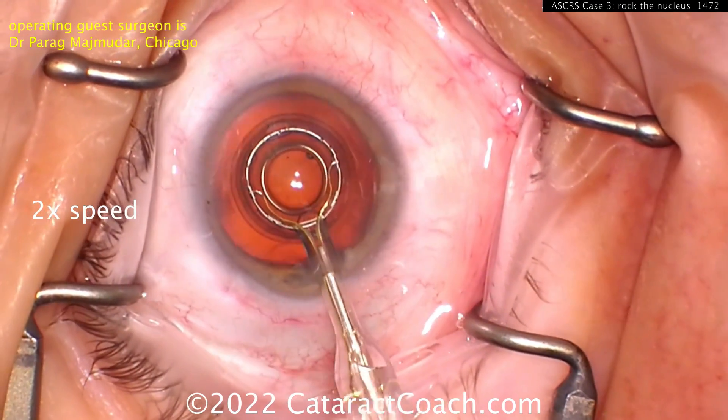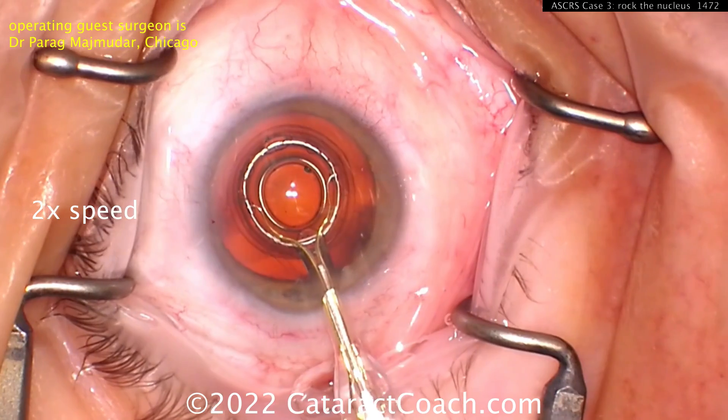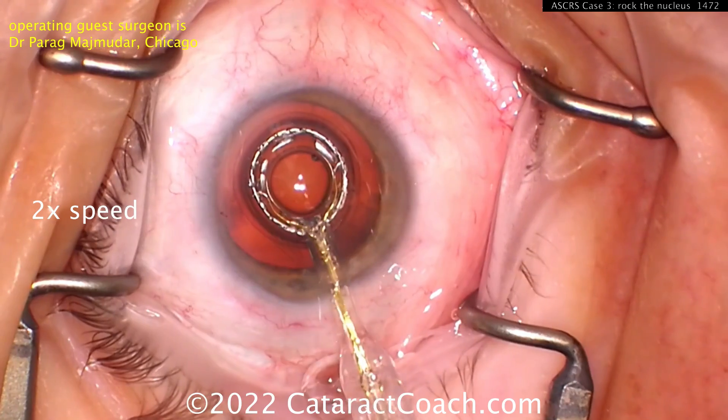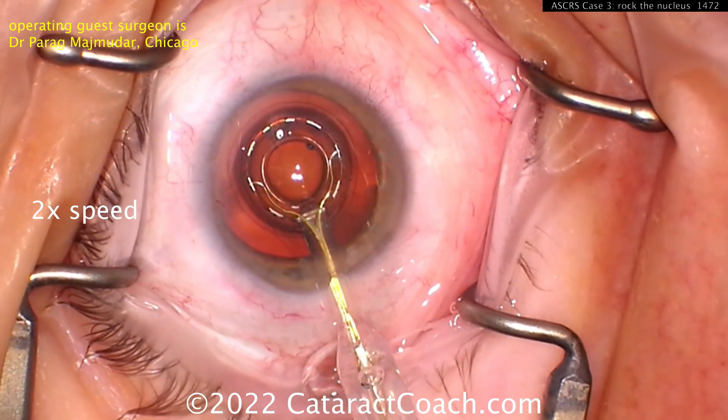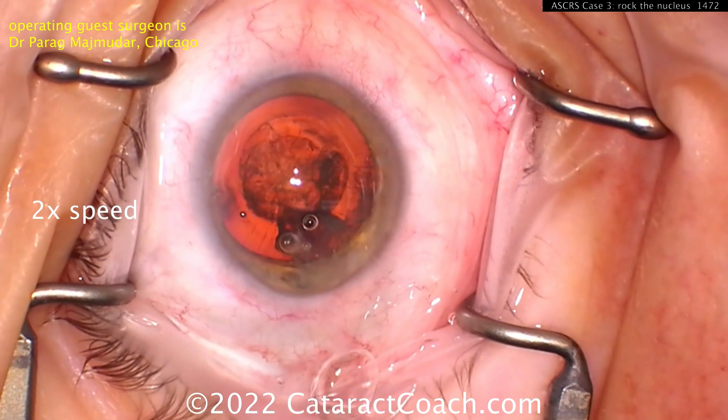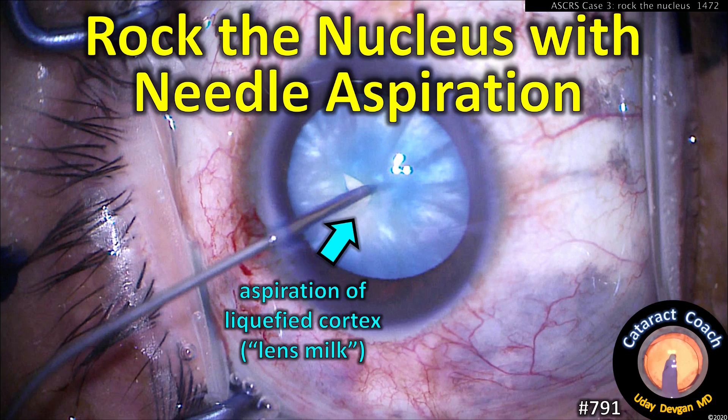The Zepto device may be among the very best options for an intumescent white cataract. In this case, you put this device on and create suction on the anterior lens capsule. A very brief millisecond or two of energy is applied to create a perfectly round capsulotomy.